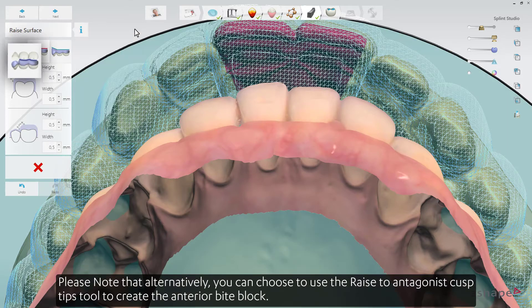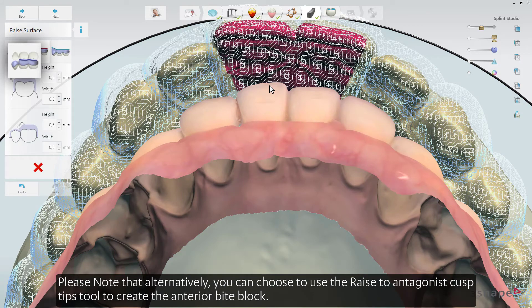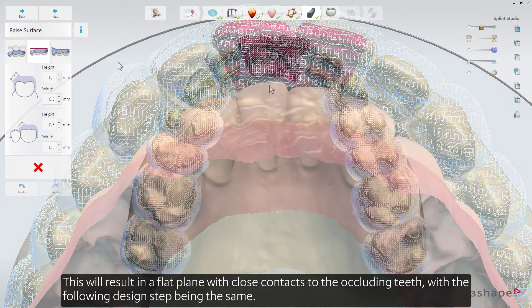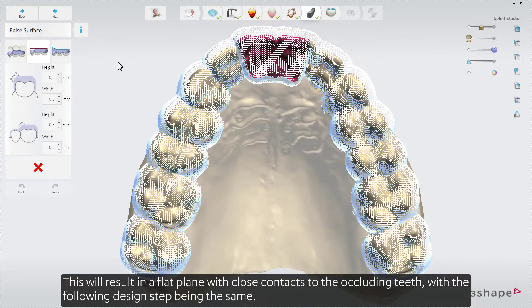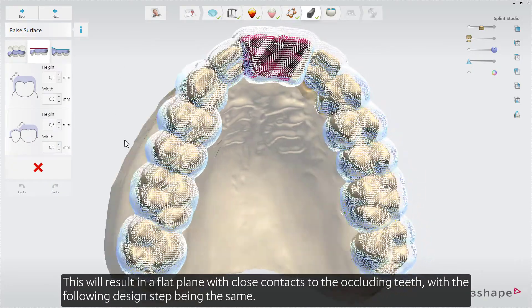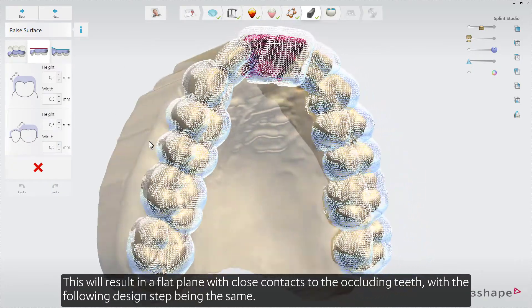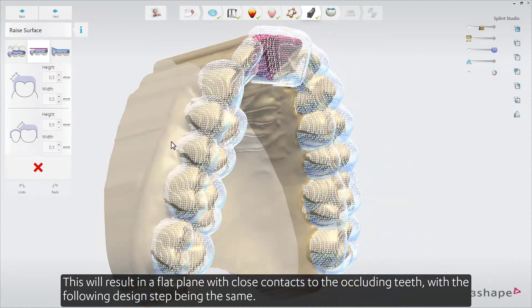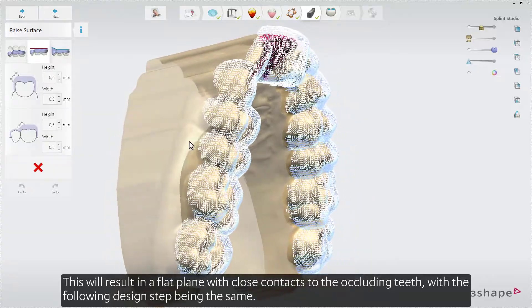Alternatively, you can choose to use the raised to antagonist cusp tips tool to create the anterior bite block. This will result in a flat plane with close contacts to the occluding teeth, with the following design step being the same.